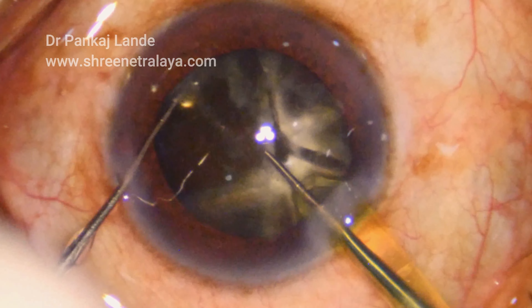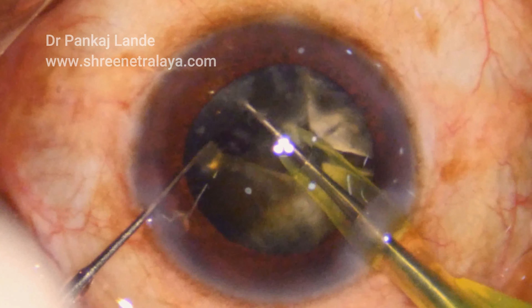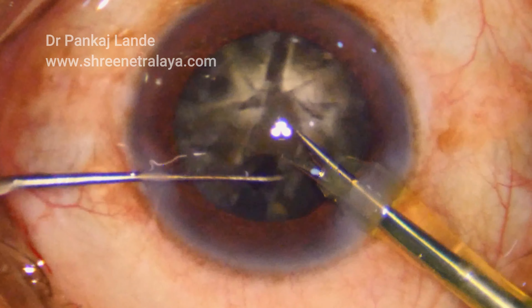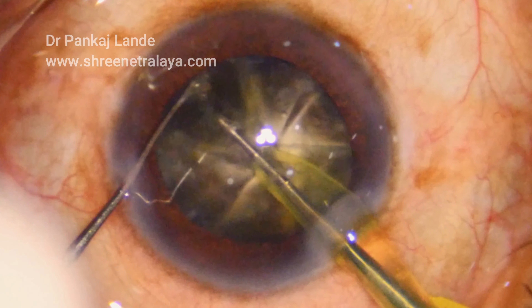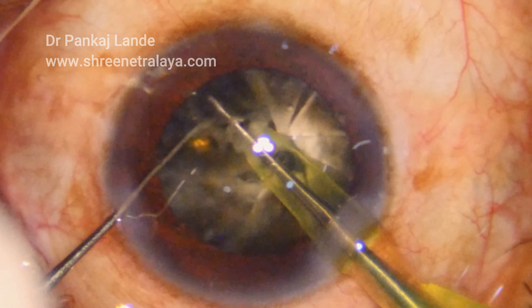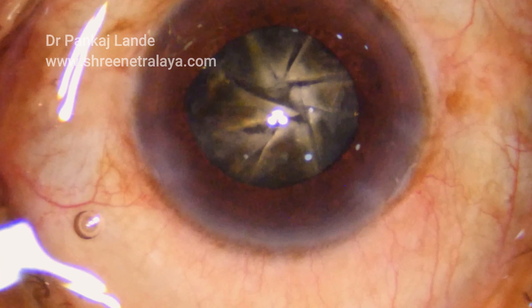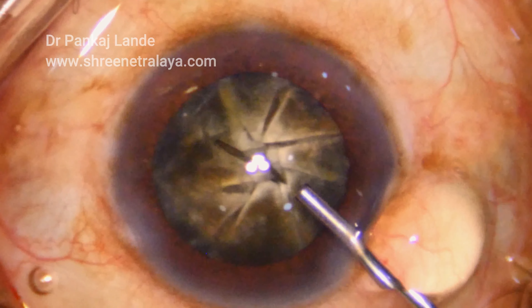Now you can note how easily I can complete it. I have completed my 8 cuts like a pizza in a very hard cataract. Taking out these pieces, I have a chopper in my left hand and I can see all the pieces are well separated.